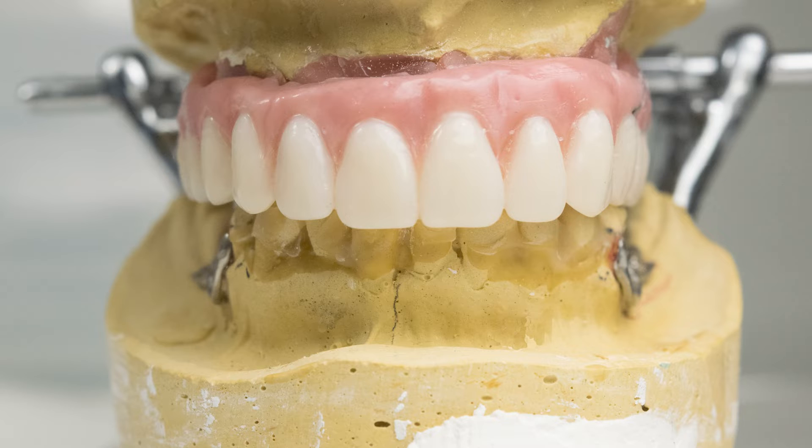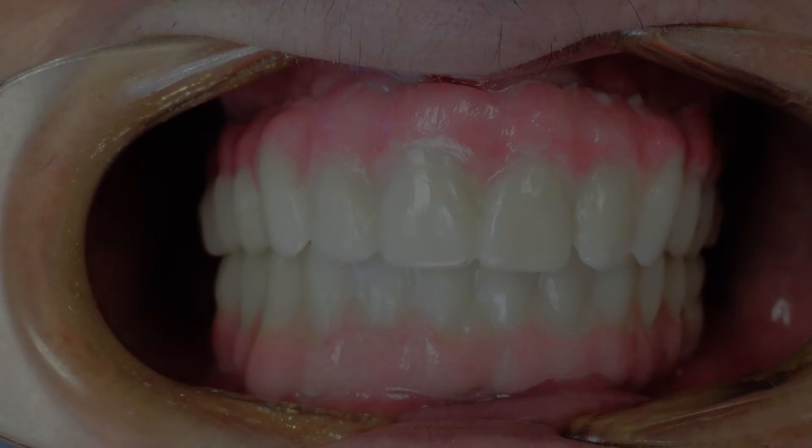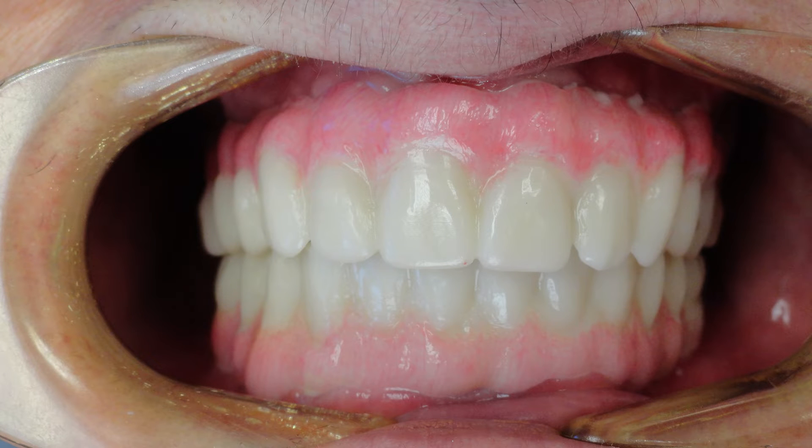A screw-retained wax try-in with denture teeth is first provided to ensure the correctness of selected tooth shade and shape, as well as tooth setup and occlusion. After the try-in is confirmed, the patient will receive a temporary PMMA appliance that is fabricated via CAD-CAM technology from the wax try-in. The PMMA provisional appliance will provide a more definitive evaluation of the final prosthesis.